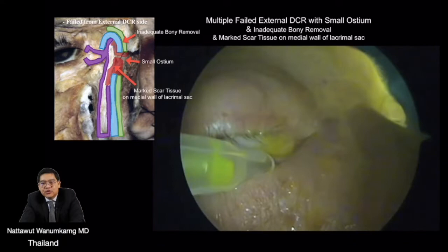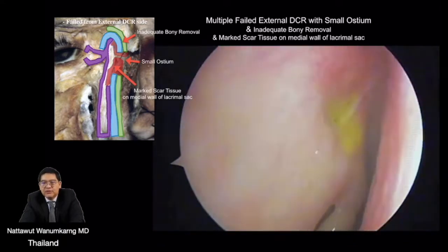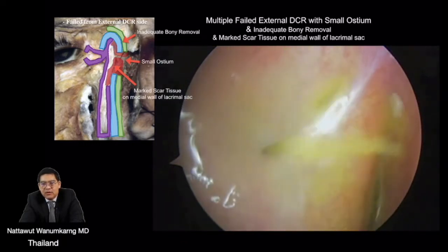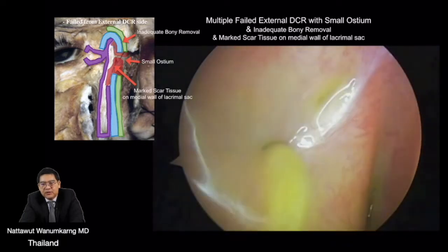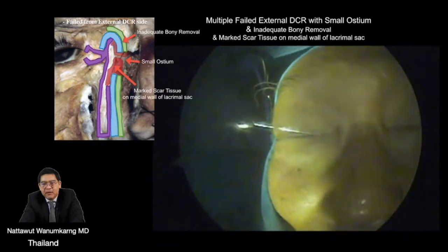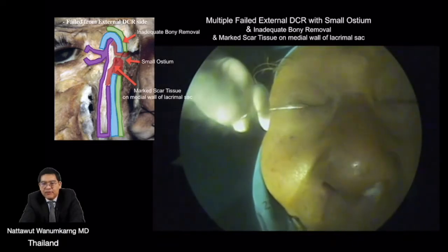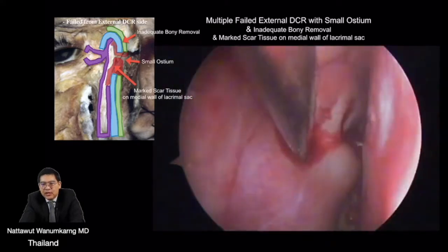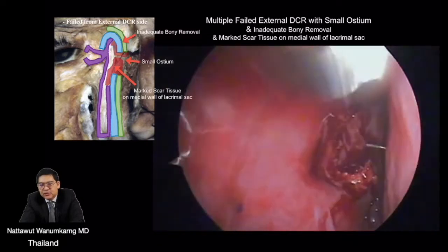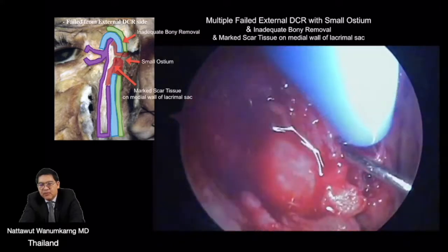This video shows complicated epiphora after multiple failed external DCRs. By endoscopic view, we can see a very small nasal ostium, and part of the water could pass through the lacrimal side. Intraoperatively, we can check the adequacy of the bone by the 45-degree test, which shows inadequate bony removal. After removal of the scar tissue and the bone, especially on the upper one-third, the ostium could be enlarged.